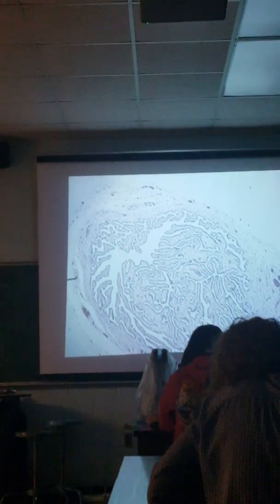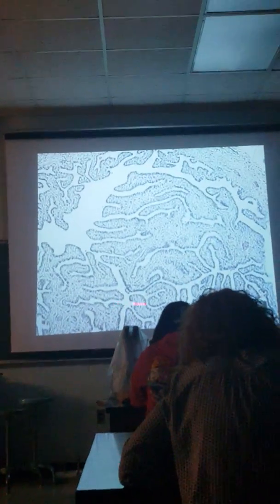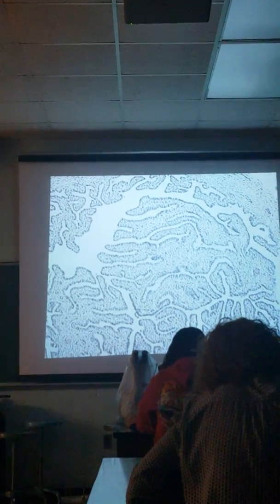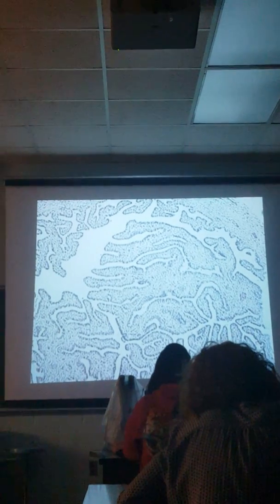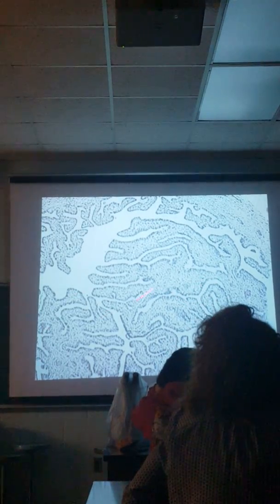If you look at the walls, the epithelium is ciliated. So simple columnar with cilia. The cilia again beat and help move that egg through the fallopian tube, and then the sperm is swimming up current and they meet, and this is where fertilization takes place.